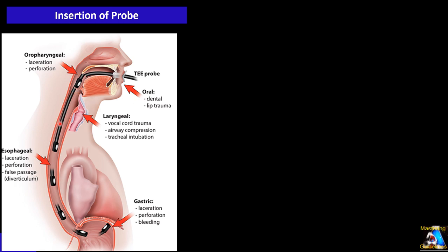And when we go more, we decrease the angle of bending of the tip of the probe. When we go at the level of the aorta, mid esophageal, we just flex a little again, anteflex. Later we talk about that.